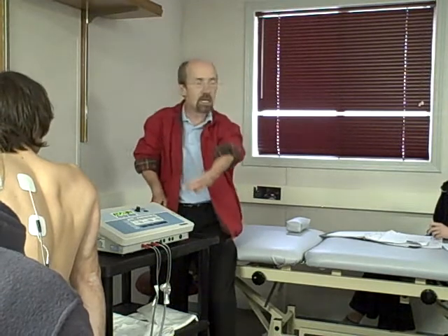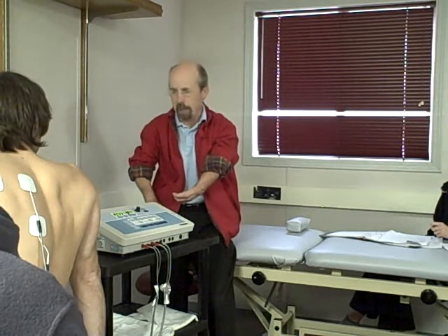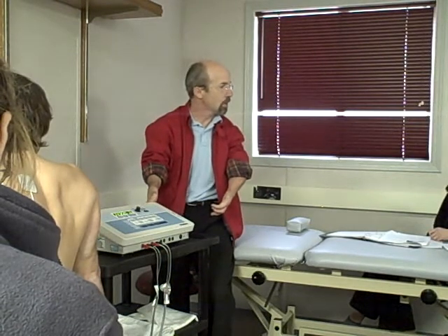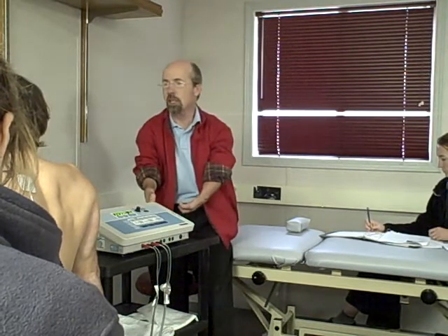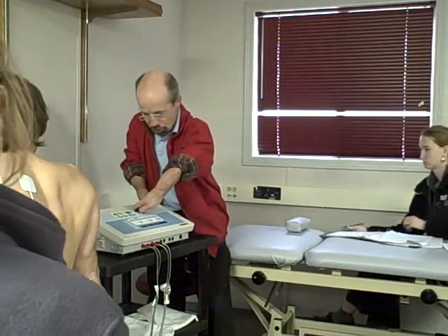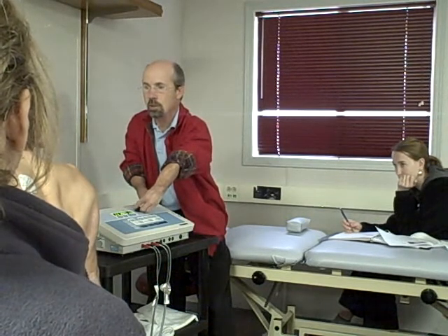But let's say he says, I don't feel it, or something's not going right. If we press this balance button, you're not changing the overall intensity, you're balancing the output between the two channels. The only reason you went there is because you know you surrounded the right area, and the patient's telling you, I don't feel comfortable, or how come I feel it over here and I don't feel it there? Now, when I press balance and start to turn this, you should feel a change in the sensation. See that?